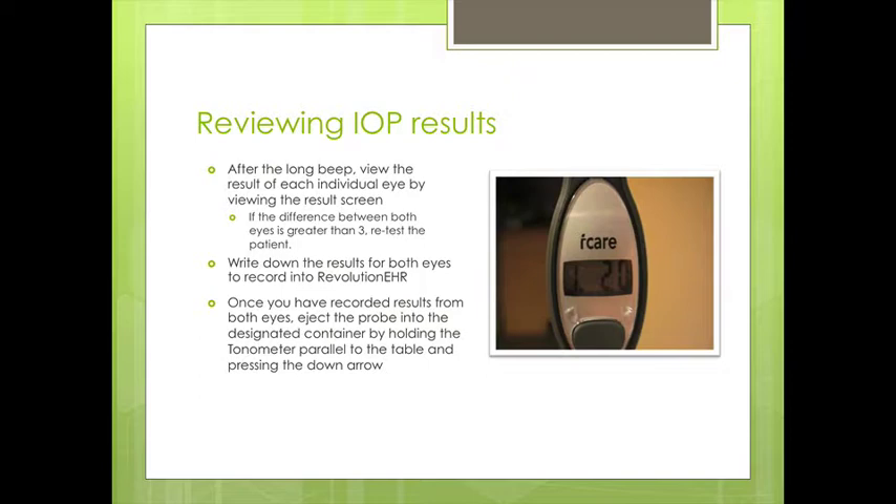A double beep means that we're not obtaining an accurate reading. After that long beep, we look at the results. If the difference between both eyes is greater than three, then we want to retest the patient.